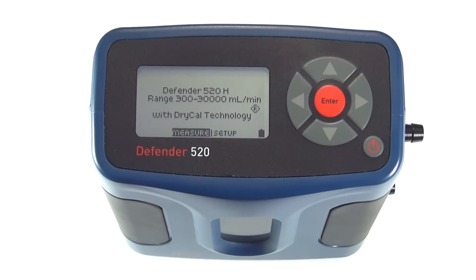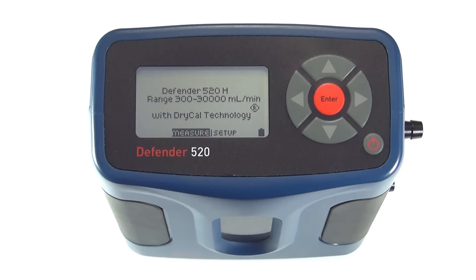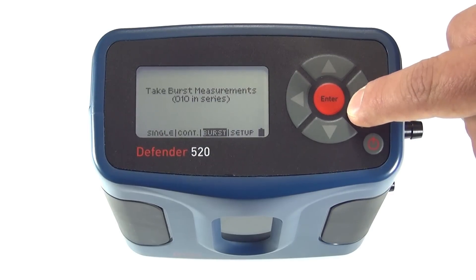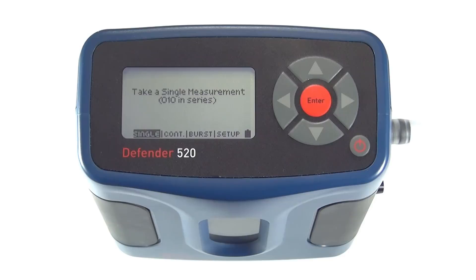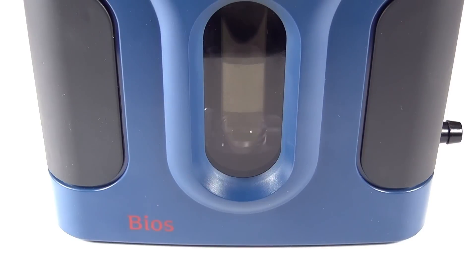The Defender offers users an easy push-button operation as well as an intuitive user interface. To take a flow measurement, simply select Measure and then select from Single, Continuous, or Burst. Once you've selected your measurement setting, simply connect your flow source and instantly begin taking readings.